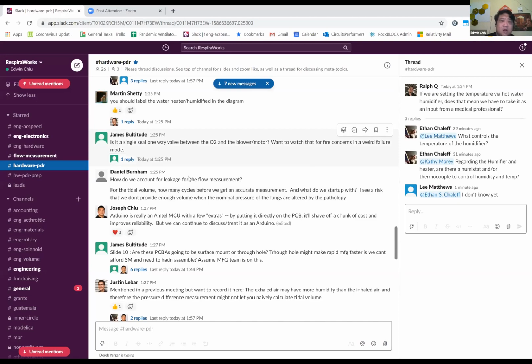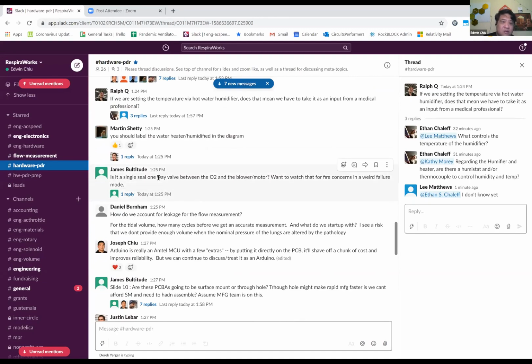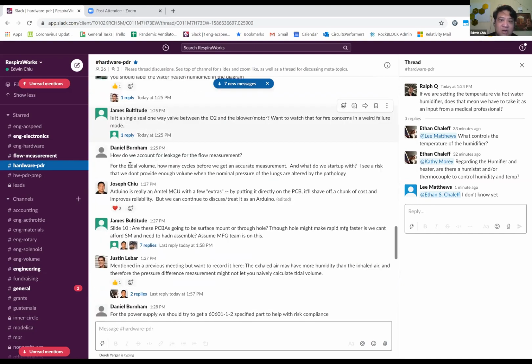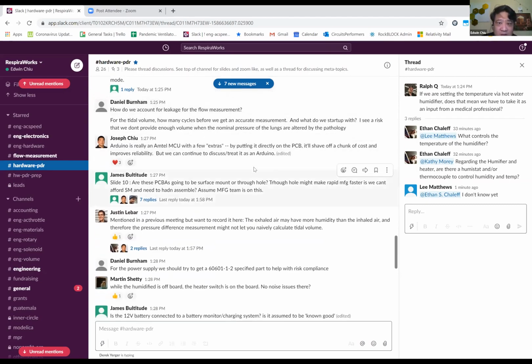Also, one thing I forgot to mention earlier about the controller setup, the Arduino is just there because it's what we had on hand, and it really is just representing hardware. We don't need to use Arduino as a platform. At the end of the day, it's an Atmega microcontroller with supporting electronics, and essentially what we need is some kind of controller with supporting electronics. So that is up for discussion.